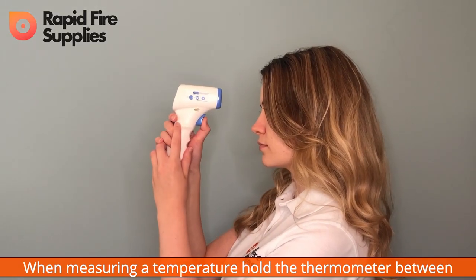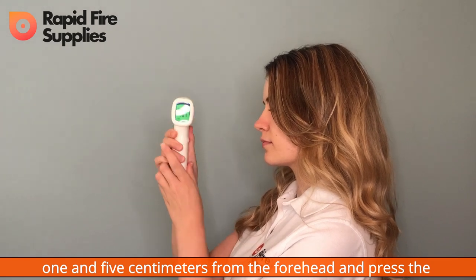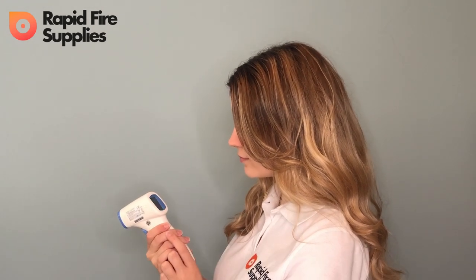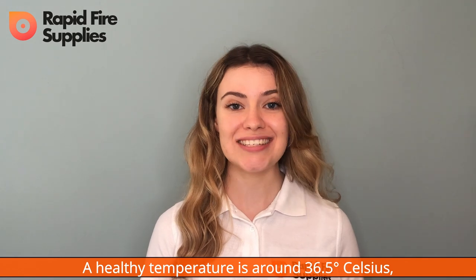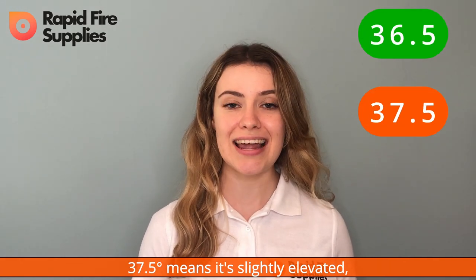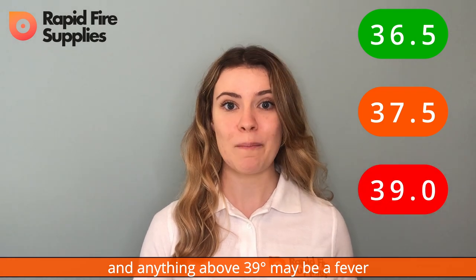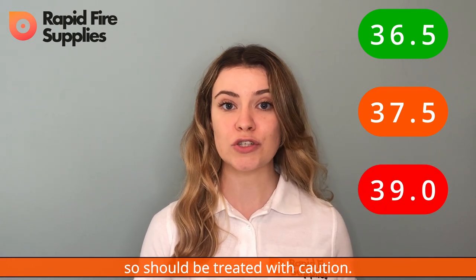When measuring a temperature, be sure to hold the thermometer between one and five centimetres from the forehead and press the measure button, like so. A healthy temperature is around 36.5 degrees Celsius. 37.5 means it's slightly elevated, and anything above 39 degrees Celsius may be a fever, so it should be treated with caution.